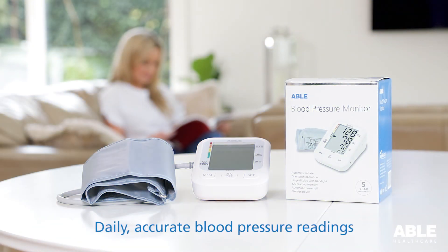The ABLE blood pressure monitor is a perfect choice for daily, accurate blood pressure readings.